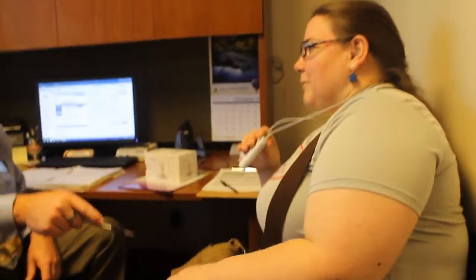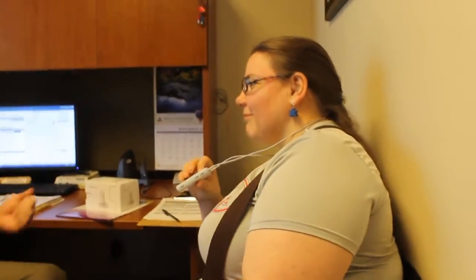It's a wireless system. So to take an incoming call, you don't even need your phone. It just has to be within Bluetooth range, which is about 30 feet. To make an outgoing call, you obviously have to use your phone. But once the call is connected, then you'll just use it through the streamer the way you normally would.